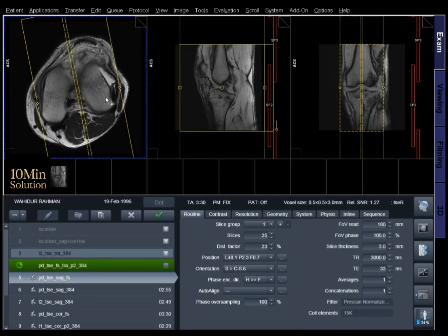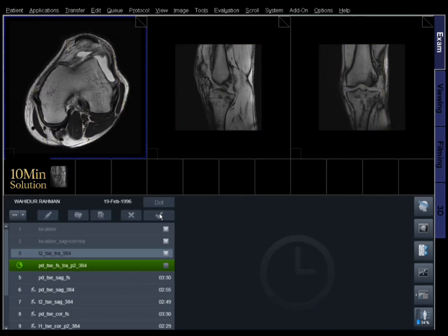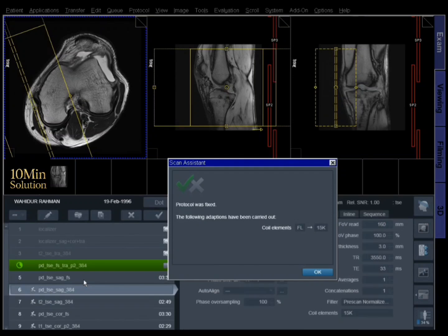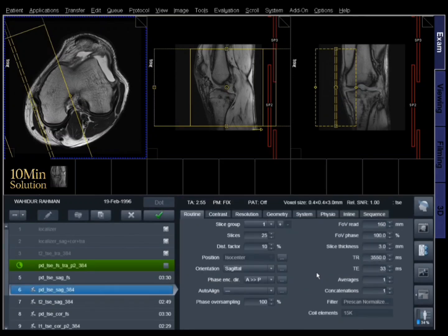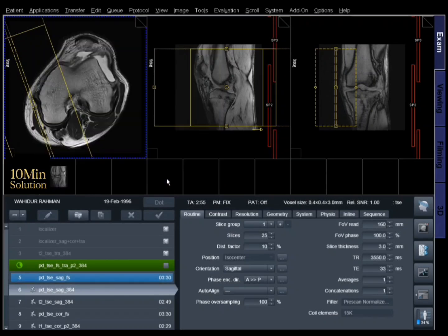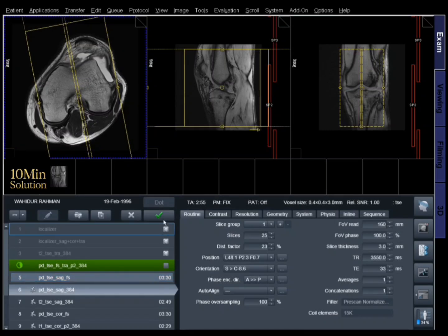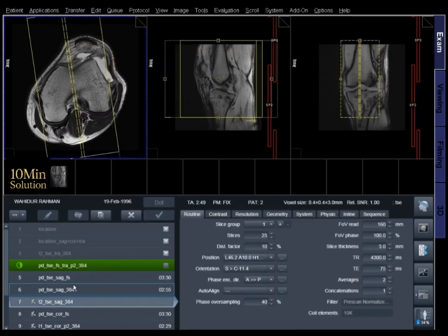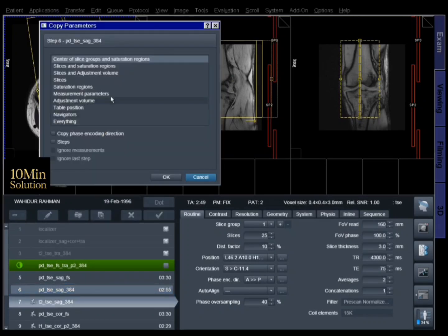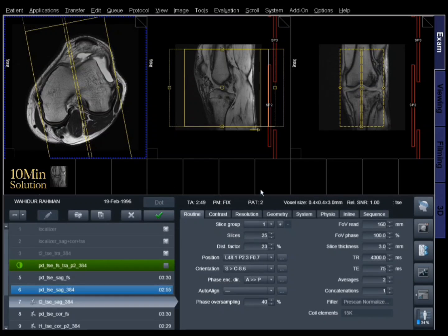or tendon tears. The joint space is inspected for joint effusion, synovial thickening, or inflammatory changes. Additionally, evaluation of the popliteal fossa helps in detecting conditions such as a Baker's cyst. Multiple MRI sequences, including T1-weighted, T2-weighted, proton density, fat-suppressed, and STIR, are obtained in sagittal, coronal, and axial planes to ensure a thorough and accurate assessment of the knee joint.